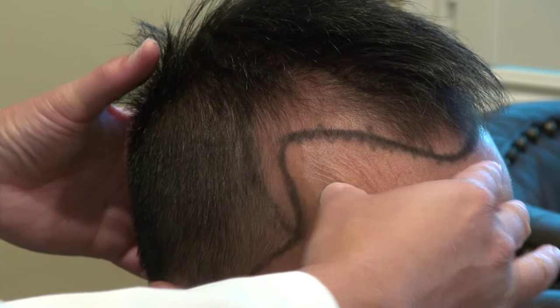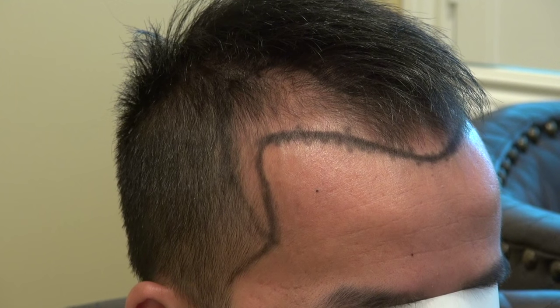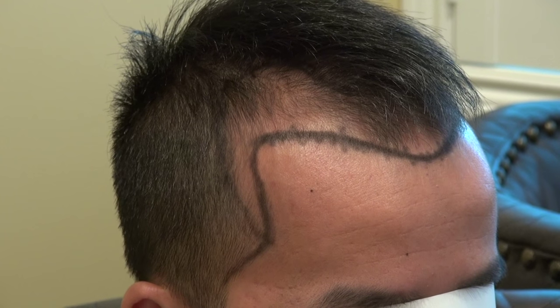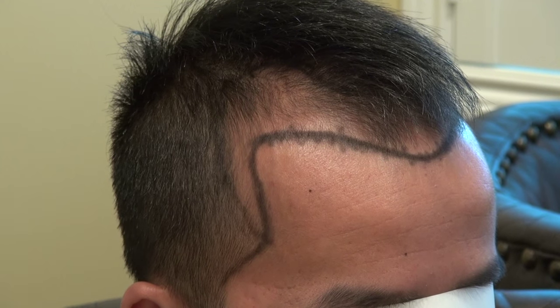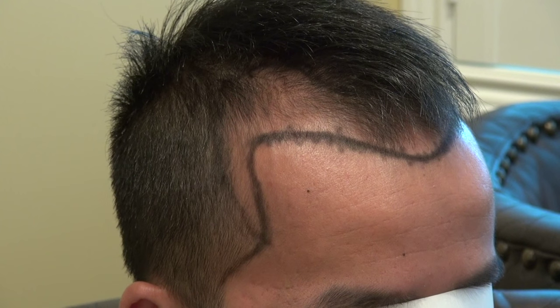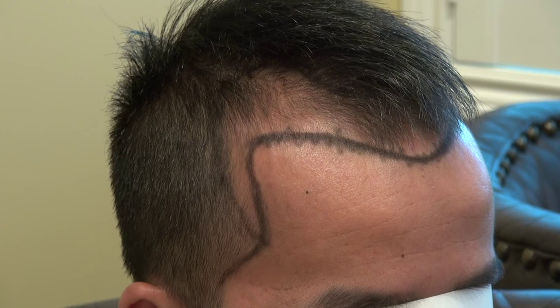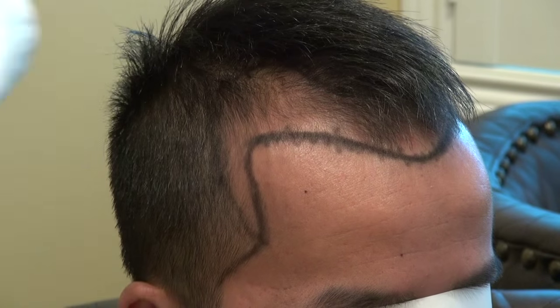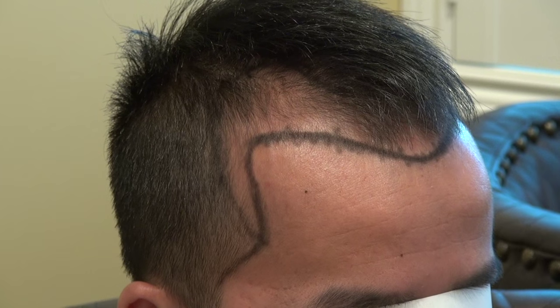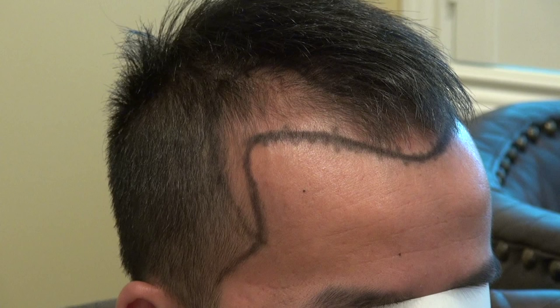This is a hair transplant restoration surgery using the FUE method. FUE is the most advanced technology available and the least invasive compared to the strip method. It leaves minimal scarring and allows you to shave your head shorter. The strip method leaves a linear scar running from one ear to the other. FUE is best for mild to moderate hair loss, while the strip method is better for advanced hair loss when you need to move 5,000 to 6,000 grafts per day, as it can move a larger number of grafts more advantageously.